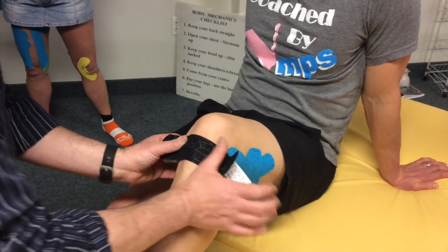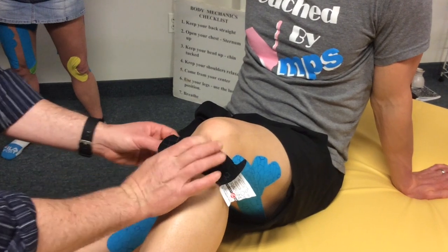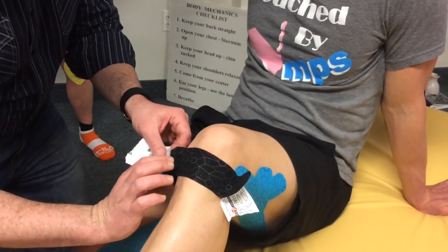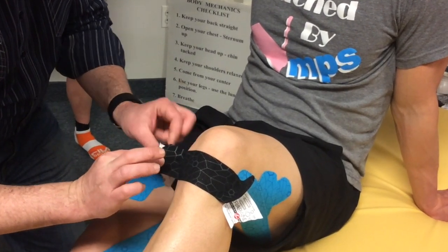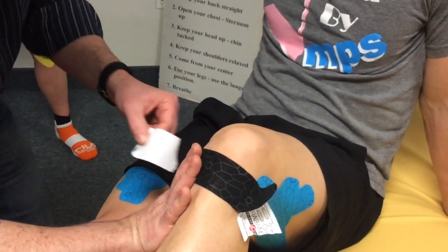Lay down the middle third of the tape over the inferior patellar tendon, primarily the spot where they feel the pain, with a downward and inward pressure. Next, lay the anchors down on either end with no tension. Activate the adhesive prior to moving to the next step.